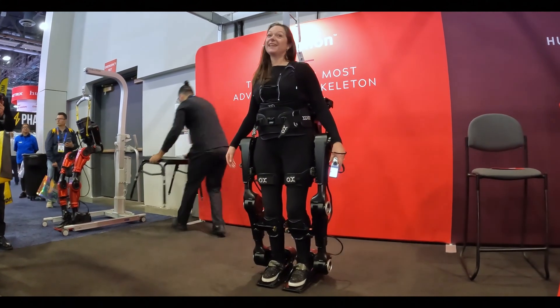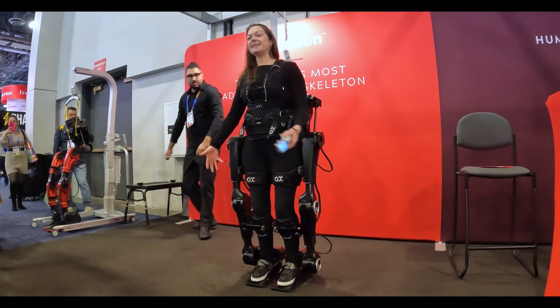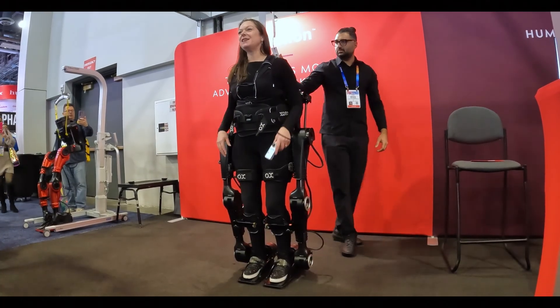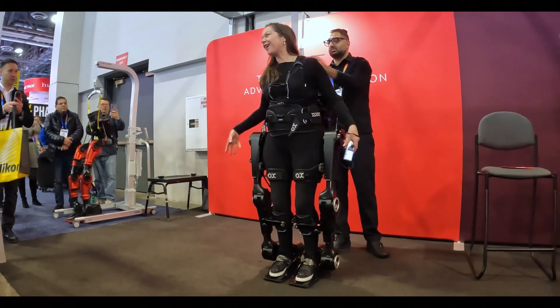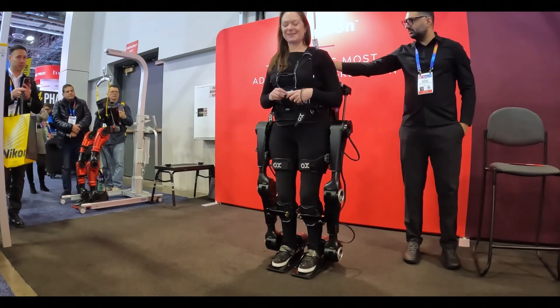You can see that this exoskeleton is independently balanced, having a series of sensors and a foot plate that allow me to stay balanced without having to concentrate on it myself. No more crutches, no more walker. It's a real advancement in the exoskeleton space.